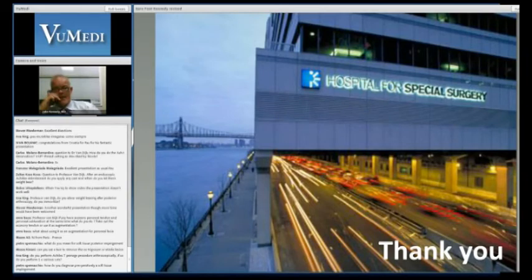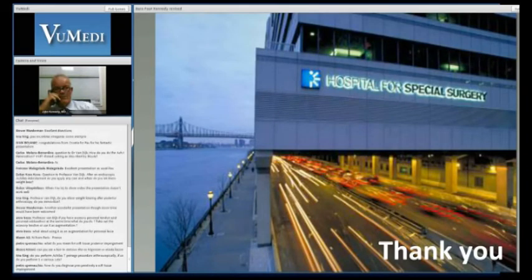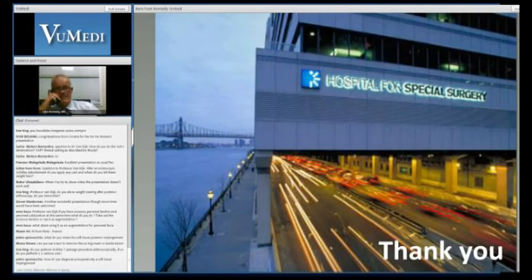Okay. Amol, what do you do? Yeah, I agree. I like to use a shaver, and there are some nice arthroscopic rasps, and I like the small osteotomes. I like to be able to see everything that could cause damage. I like to be able to visualize that posteriorly, especially. Okay. Well, I think one should be very careful in using a burr. I use a fairly aggressive shaver, but that's all.